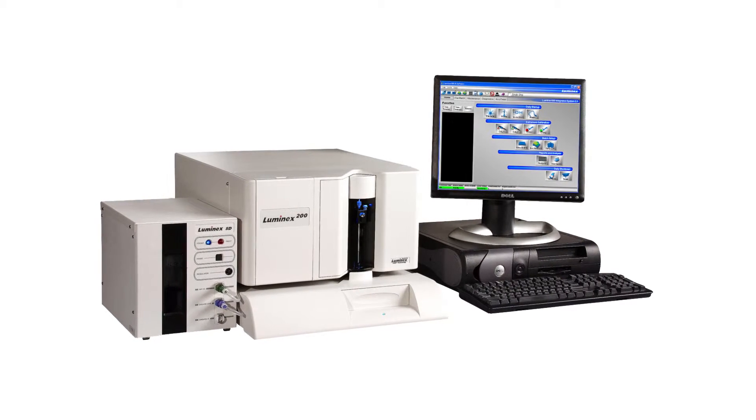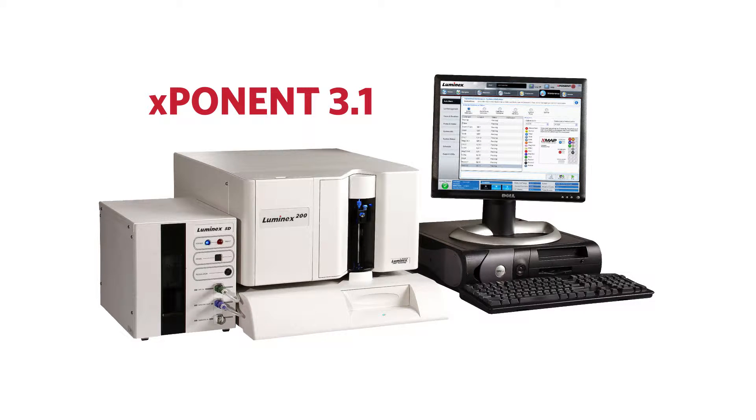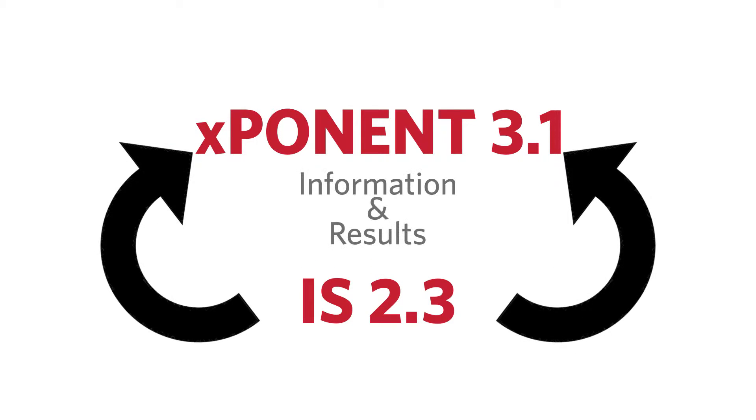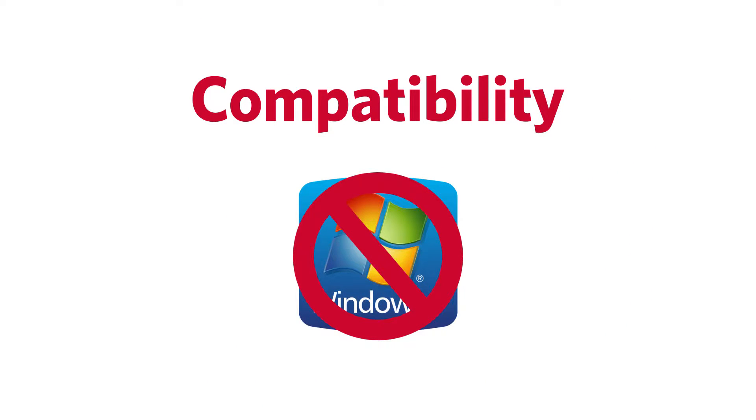Let's go over how to update the Luminix IS 2.3 software to Exponent 3.1 software for your Luminix 100 or 200 instrument. You will be able to upgrade to the new software without losing batch information and results from previously run tests on the older software. It's important to upgrade for compatibility issues, as the Luminix IS 2.3 software is not compatible with Windows 7.